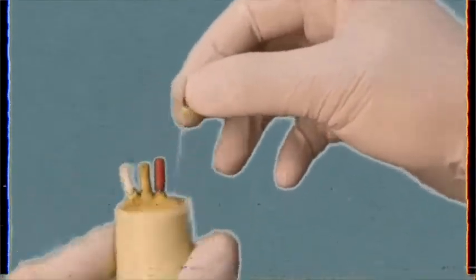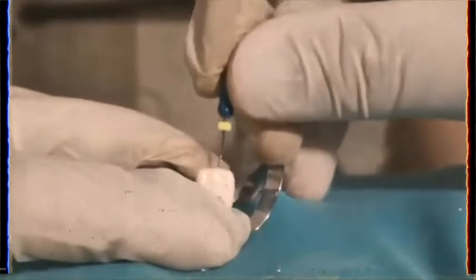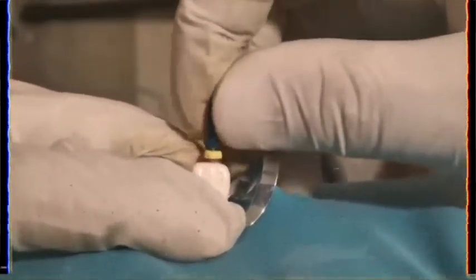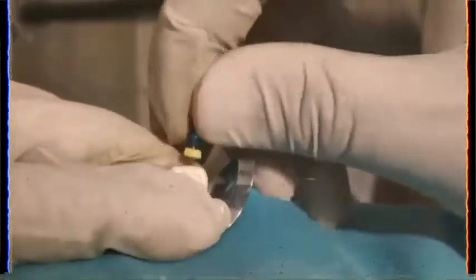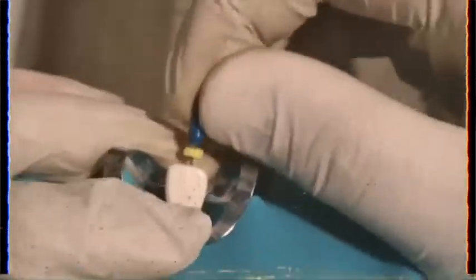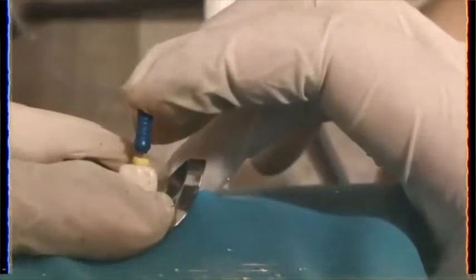We have finally arrived to the MAF. Using the MAF, you must do a final circumferential filing motion to remove all ledges made by the previous files. Slightly introduce apical pressure to see if you have successfully created an apical constriction.